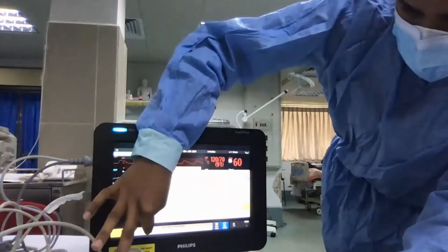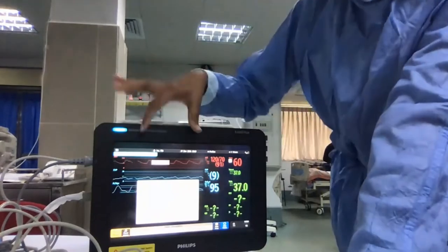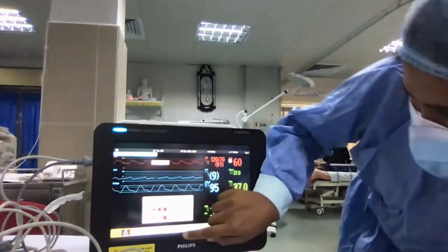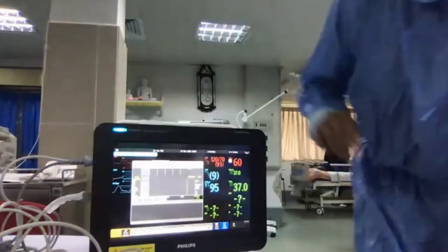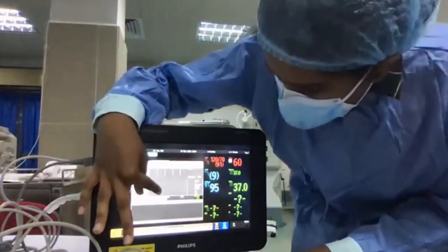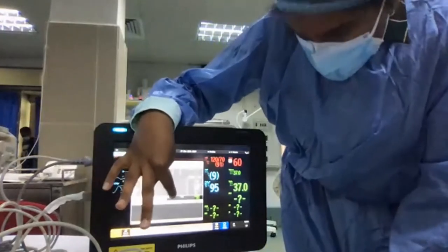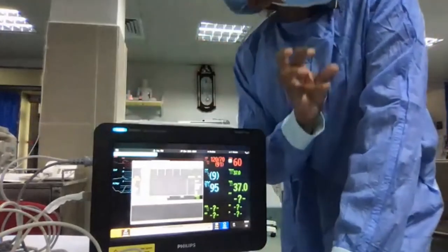And then you have to confirm from here, and all the patient details will be admitted here. Before anything else, you have to enter the patient details. Then we will go to the cardiac output screen. Now, based on this patient's height and weight, the BSA is 1.59 square meters. Body surface area is 1.59. Then, based on that BSA, the monitor will be recommending the injected volume, madam.